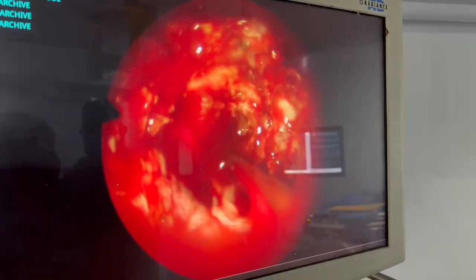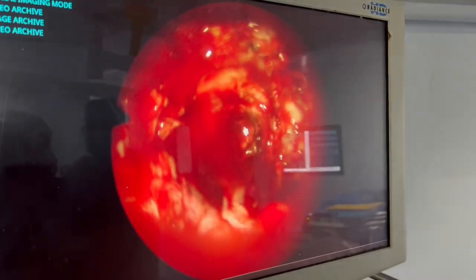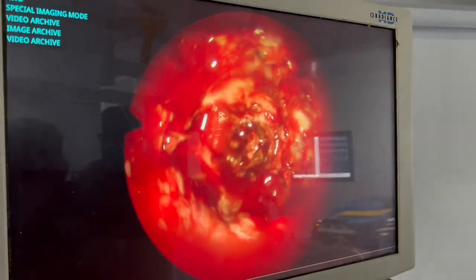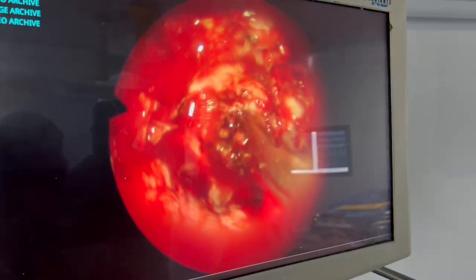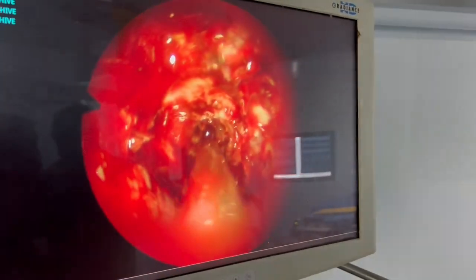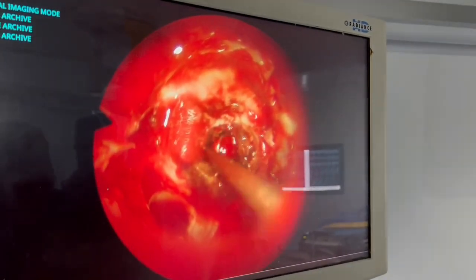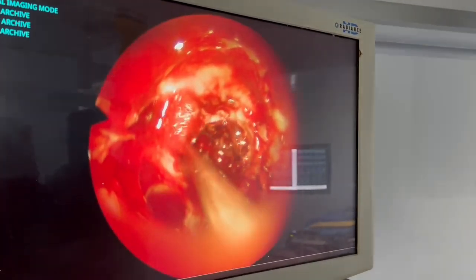In the sellar phase, internal tumor debulking or central decompression should be done first. Use suction or a curette to aspirate the soft necrotic or hemorrhagic tissue first and create a space within the capsule. After clearing the central part, dissect the inferior and posterior tumor. After removing the posterior and inferior parts, go to the lateral tumor extension and remove the tumor from the lateral part. Ultimately you can go for the superior part, decompressing the optic chiasm safely.